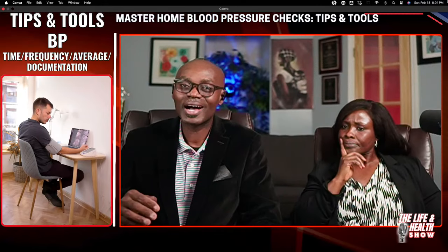So when you sit to take the pressure, even though you waited 5 minutes before you put your arm in the cuff, you probably still had your heart racing or pumping hard a little bit from doing all those things. So your first try may be higher. So you wait after that and then do another trial. As a matter of fact, it is even recommended that you take 3 readings in a shot, but people don't have time. So if you can do even 2, praise God, we will take 2. But if you can, then do 3 readings and strike an average.